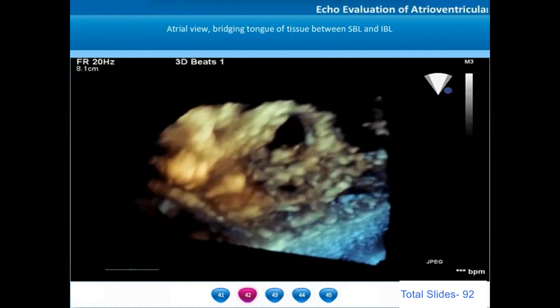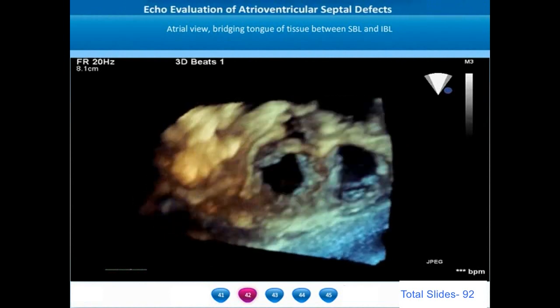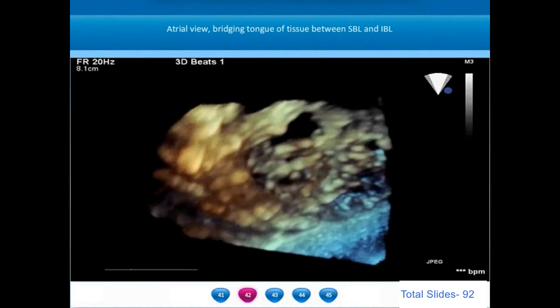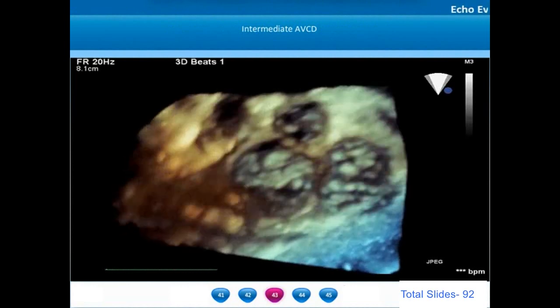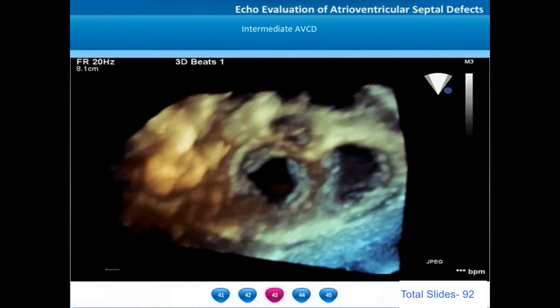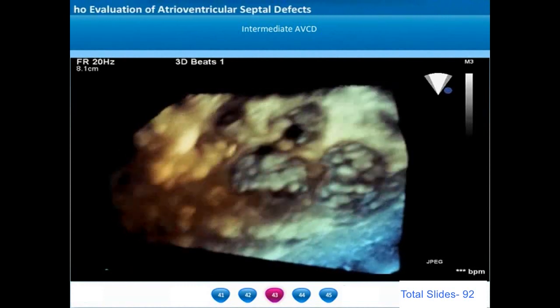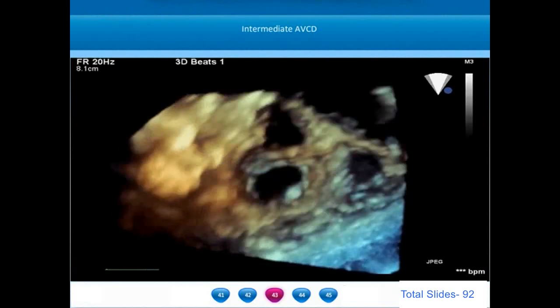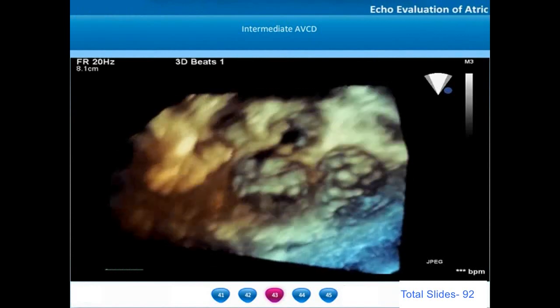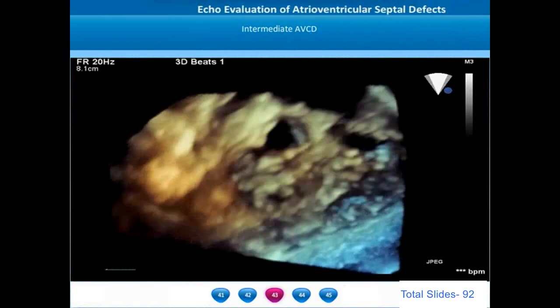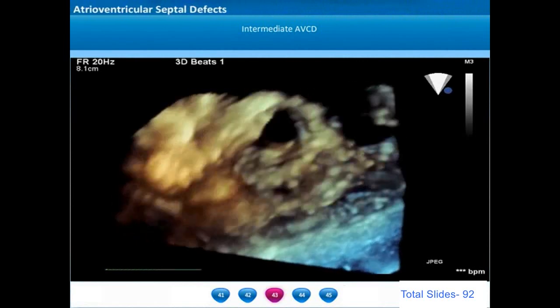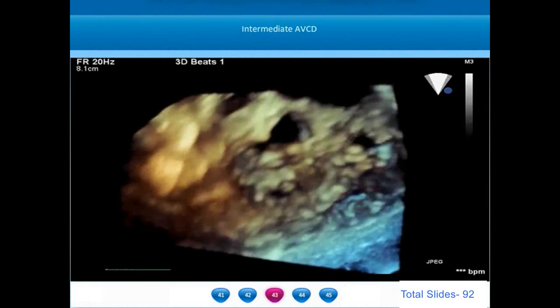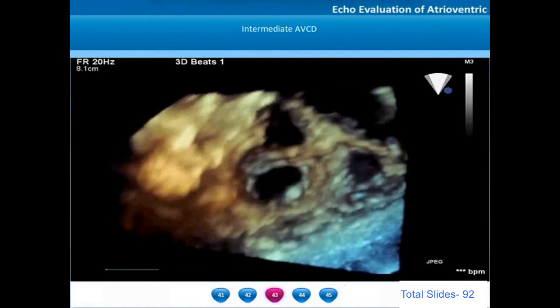From the ventricular view, the superior and inferior bridging leaflets are not totally separating because of the small bridging tongue of tissue. On the atrial en-face view, the gap between the superior and inferior bridging leaflets is called the zone of opposition or the cleft of the anterior mitral leaflet. The differentiating feature between intermediate and transitional AV septal defects: intermediate has a common AV annulus, whereas transitional has a fairly well-divided AV valve annulus. In intermediate defects, the primum ASD and inlet VSD will be moderate to large in size.